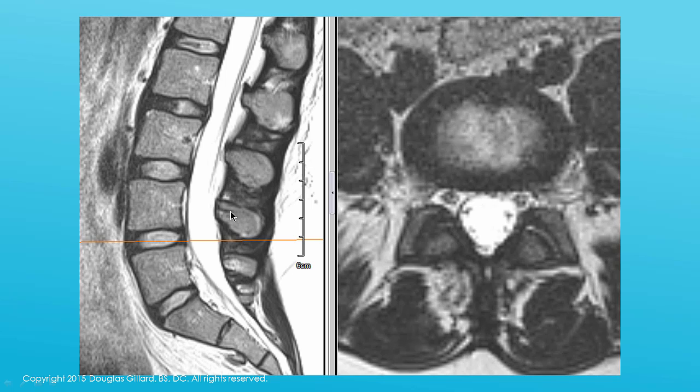Well, where's the, like in an x-ray, this would all be colored in, because these are slices again. This is three-dimensional. So we're looking at a slice. I got the cut line in the wrong place, but the slice would be right down here, the middle. So we're looking at a slice through the middle, so you can't see the pedicles that come over. Now this yellow, this is a cut line again, goes right through the L4 disc. So if this patient was standing up and you sawed him in half with a chainsaw and you looked down at the stump to see the rings of the tree, this is what you'd see.